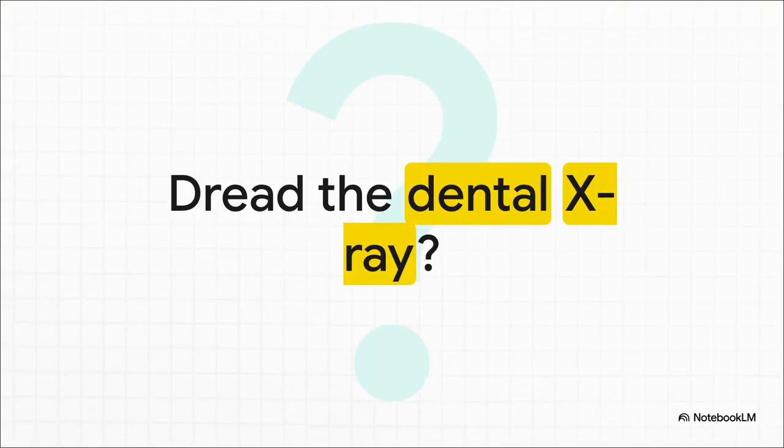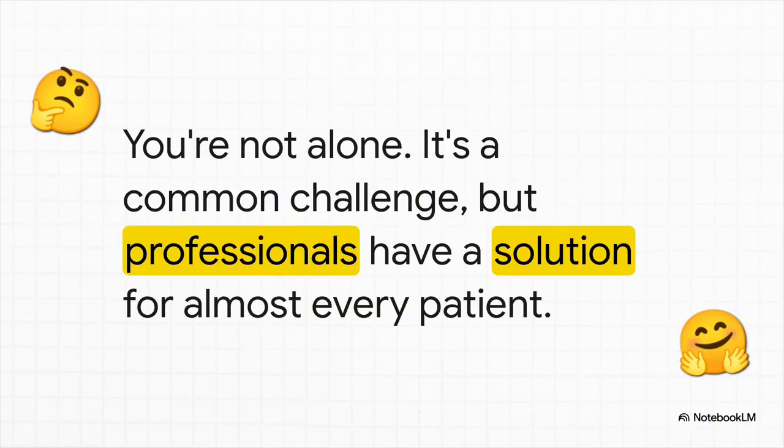So, does this question hit a little too close to home? You know that feeling. The lead apron comes out and you know exactly what's coming next. For so many of us, the idea of holding that little sensor in your mouth is, well, it's not exactly fun, right? And look, if that's you, you are so not alone. It's a really common challenge. But here's the good news. Dental professionals have this entire toolkit of strategies and different technologies to help. And that means there's a solution for pretty much every single patient and every situation.